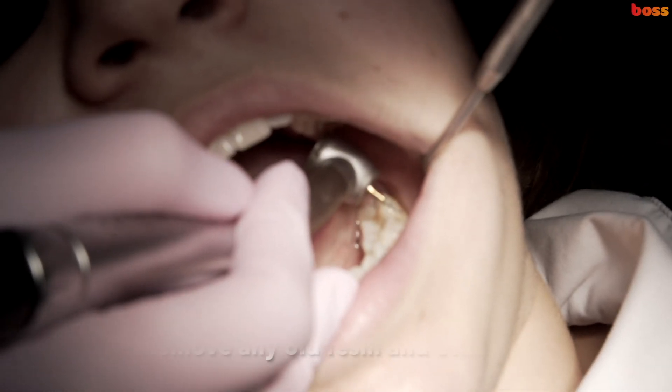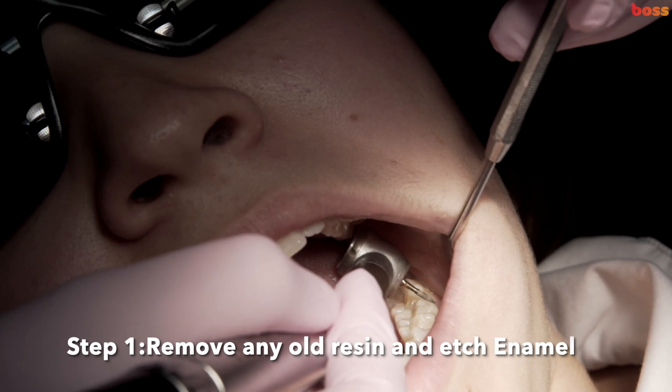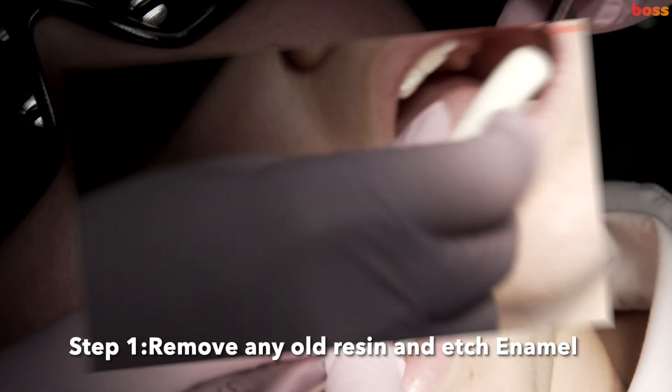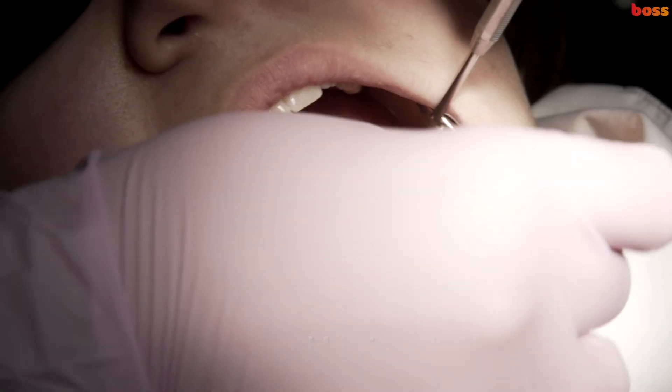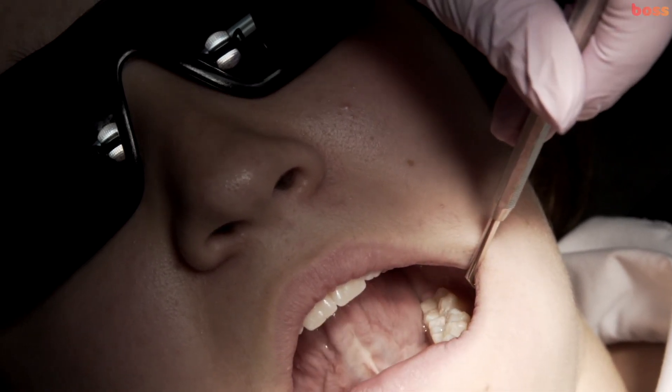The old resin is being removed with a coarse diamond bur. Some people will use a fluted tungsten carbide. Give a good 30-second etch to the enamel surface, and moisture control — very important.